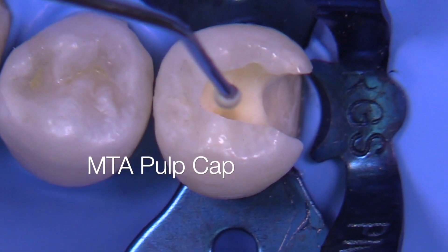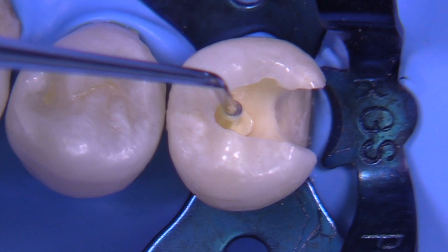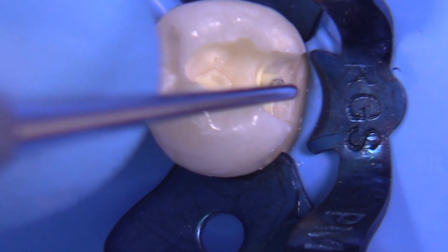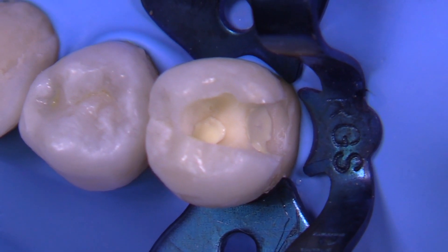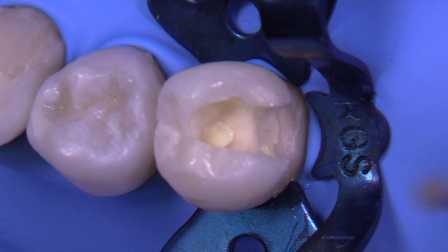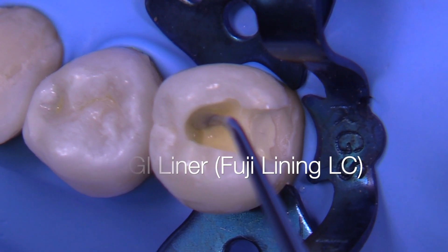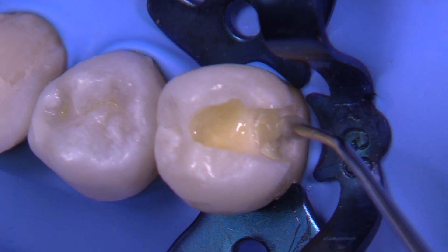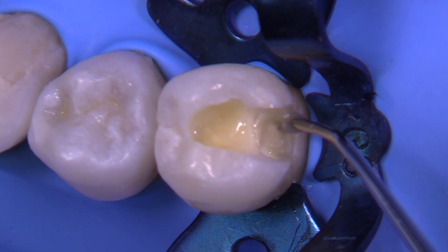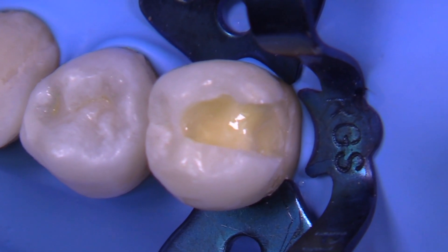Let's go ahead and place some MTA. The type I'm going to use comes out of a tube — there are many available. It's not technically the original MTA formula because that would have taken many hours to set, so this is a variant. The key is that you need to tack it down. Take a material like a glass ionomer that is not too viscous, something that flows, and gently touch the tooth next to the MTA and let it flow over it. I'm using GC Fuji Lining LC — it's light-curable — to create a nice little base that tacks down the MTA. Don't make it too thick; about half a millimeter is sufficient.